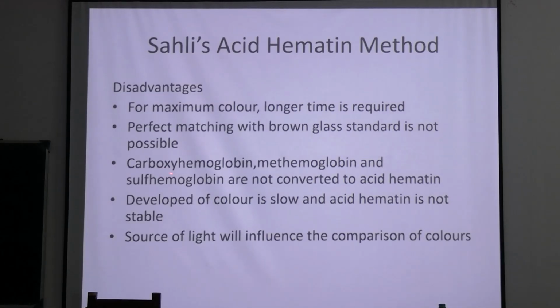One of you will see that the color is not matching, and think I need to add 2 or 3 more drops of distilled water. Another one will think, no, the color is exactly matching, there is no need to dilute it anymore. So, there will be person to person variation. In any case where you are taking the reading by your bare eyes, there is this problem.